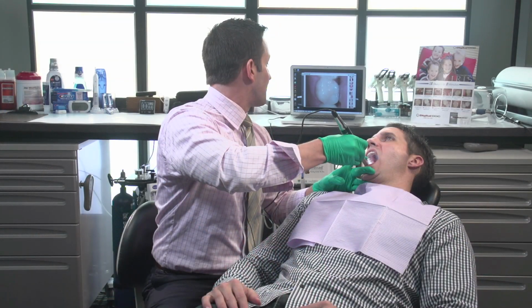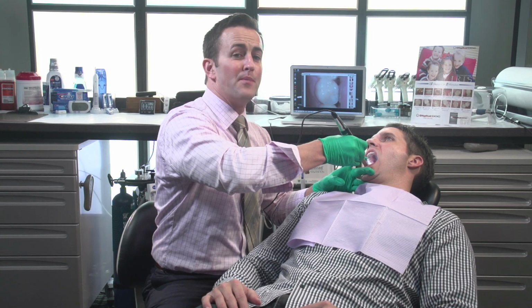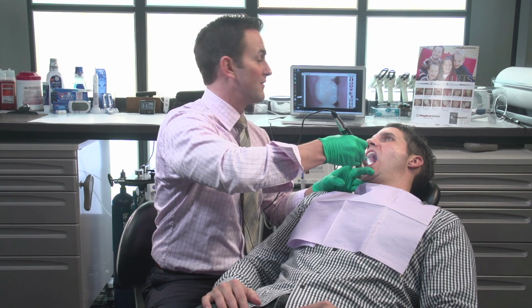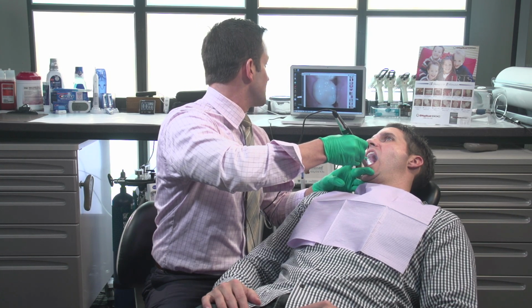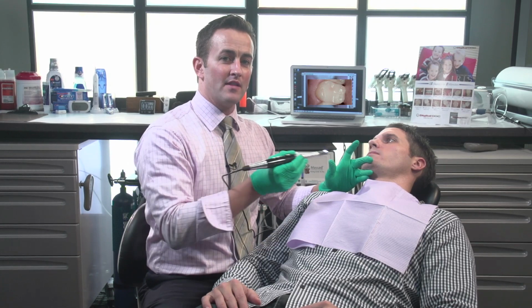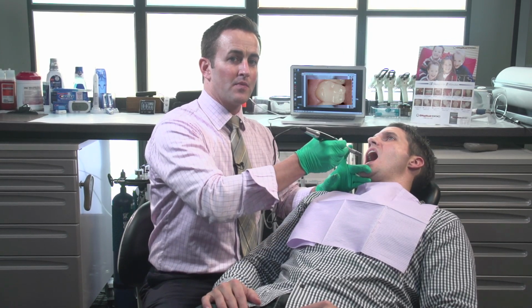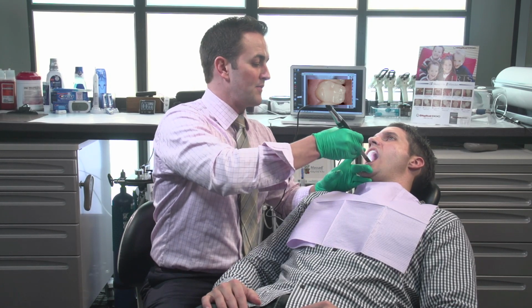Get a live image. It lines itself up perfectly with the anatomy of the opposing arch. If you need to make any adjustments, you're having the patient open and close to find the desired focal range. Here's a great shot. However, if you find yourself in a position, maybe a pediatric patient or someone that can't hinge properly, then at that point, you're still having the opposing hand positioned off the labiomental groove, but then we're sliding it slightly over to the buccal vestibule to give you additional depth of field, all right?